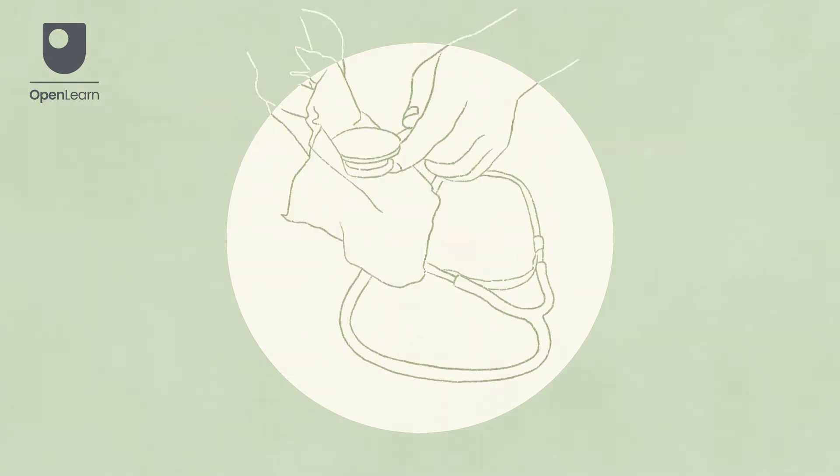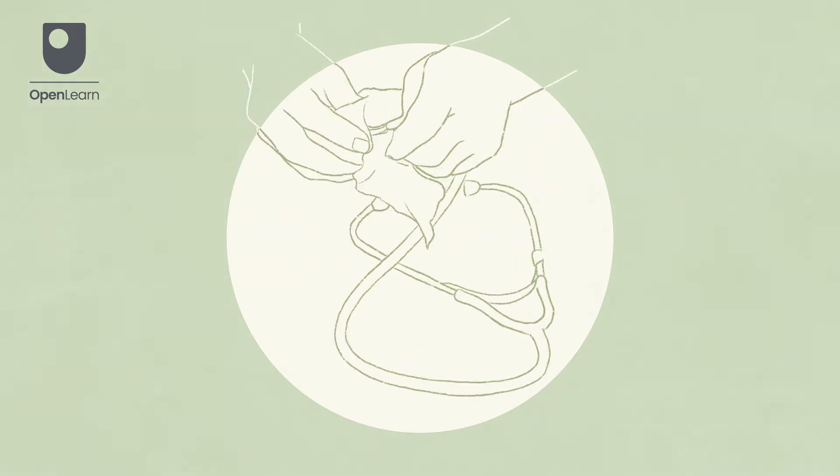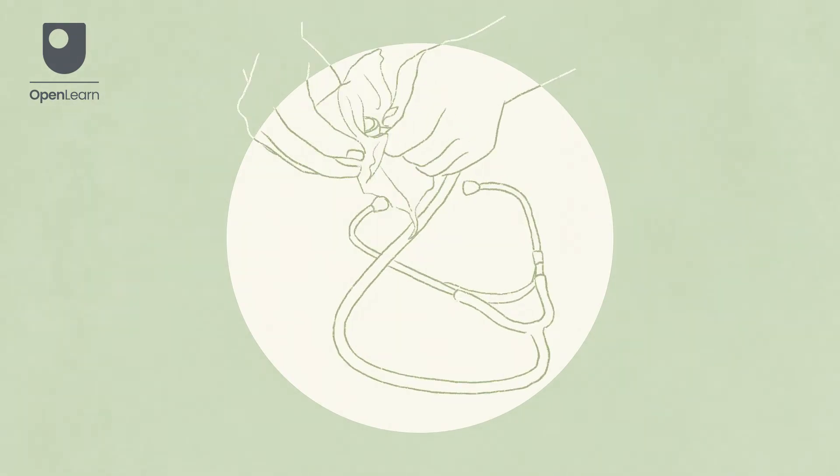It is important to ensure your stethoscope has been cleaned and allowed to dry. Always follow local infection prevention and control guidance.